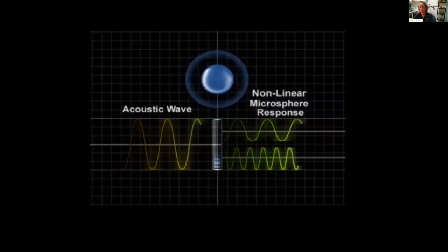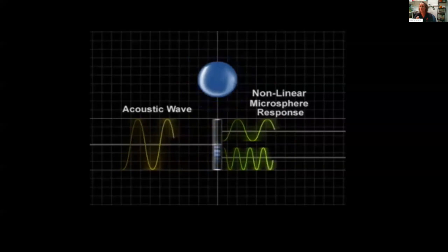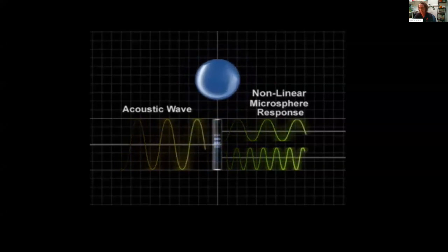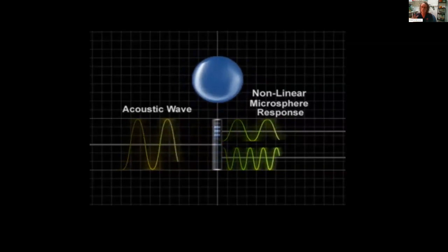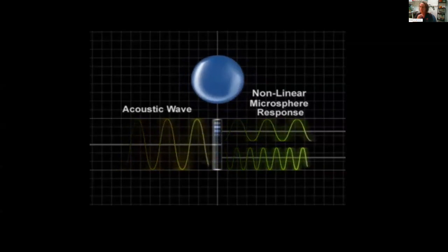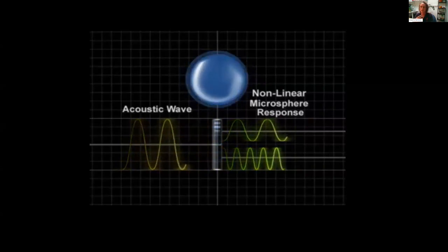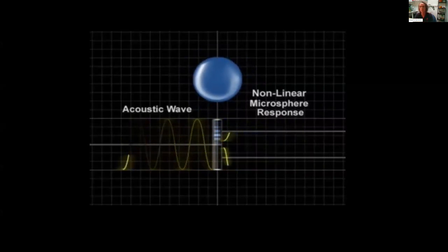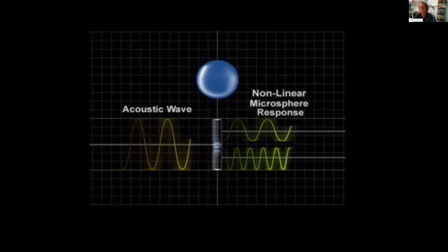But the problem with imaging contrast at a harmonic frequency is that it requires a relatively high mechanical index. And any of you who've ever injected contrast and have not gone to your low MI setting, there's an awful lot of bubble destruction. And this high MI will destroy and eliminate most of the contrast. And it makes it pretty unsuitable for real-time contrast imaging.